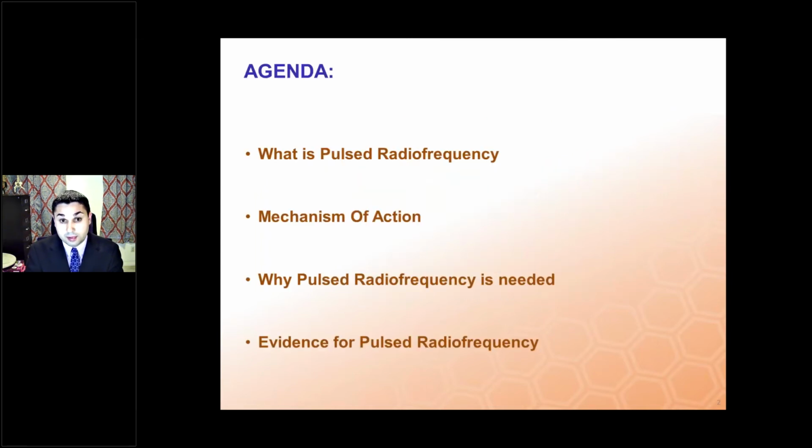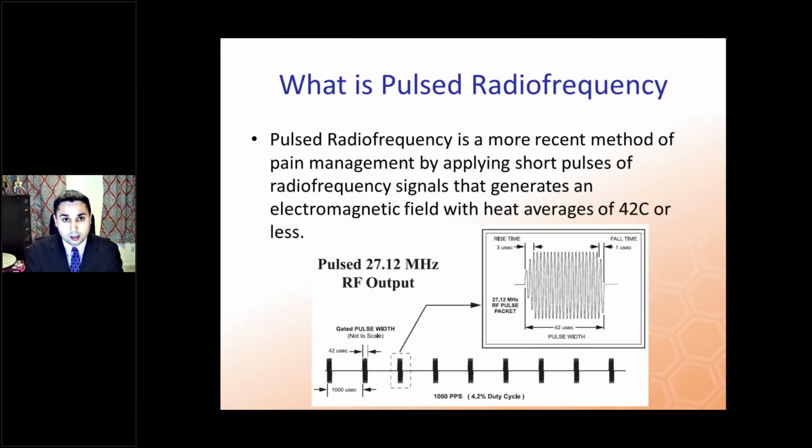This is a brief overview of the agenda, going over what is pulse radiofrequency, how it works, the mechanism of action, why do we even need pulse radiofrequency, and what is the current evidence from a literature standpoint in regards to pulse radiofrequency.